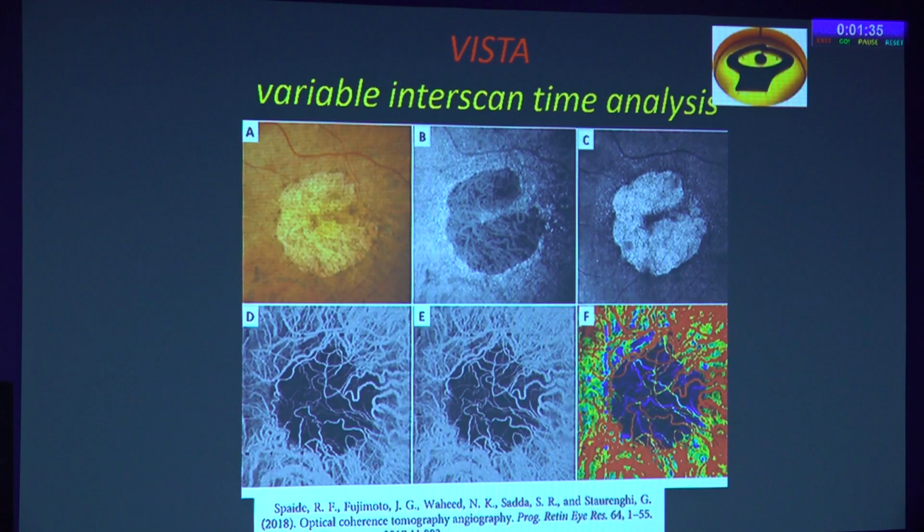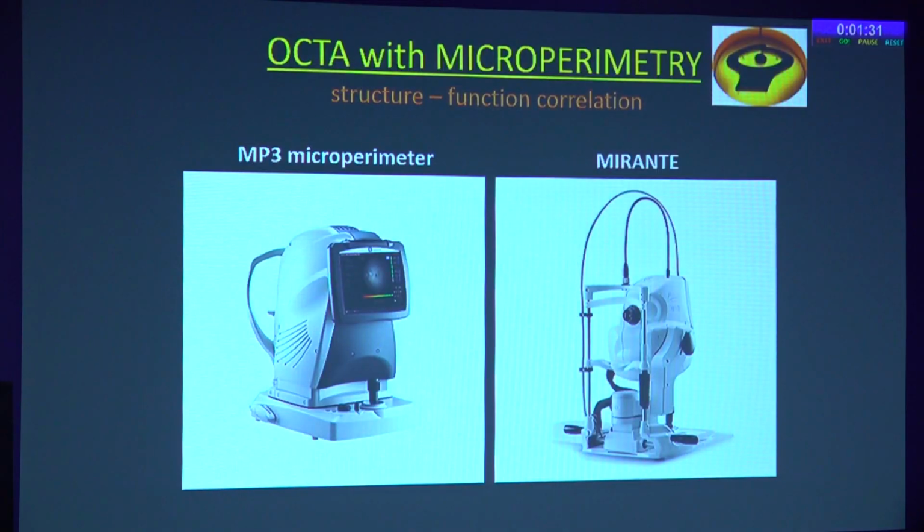So this patient can have a progressive atrophy in future. So this is how it is utilized. And the OCTA can also be incorporated along with the microperimeter. So this MP3 microperimeter software can be integrated with Mirante.